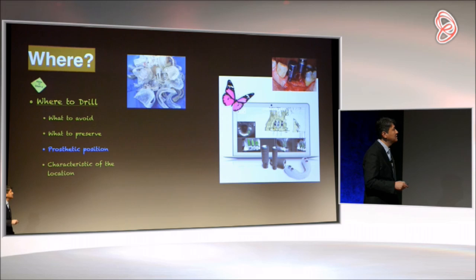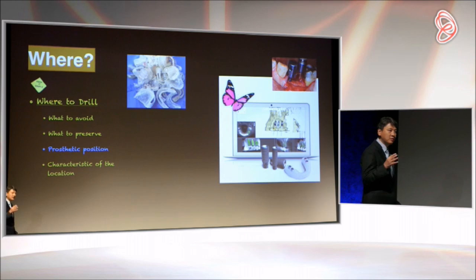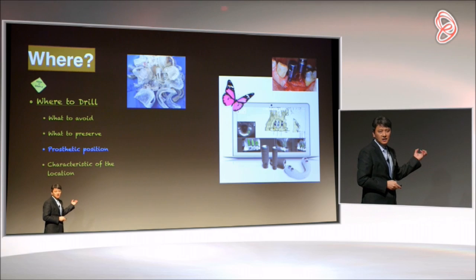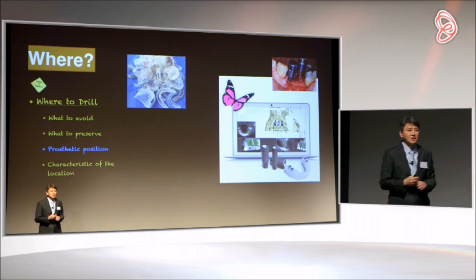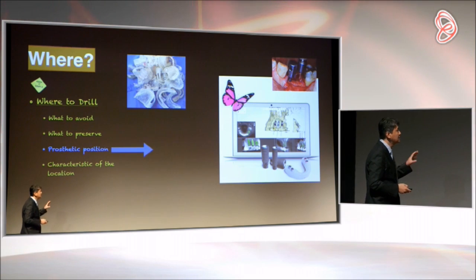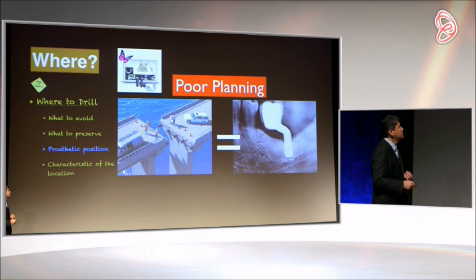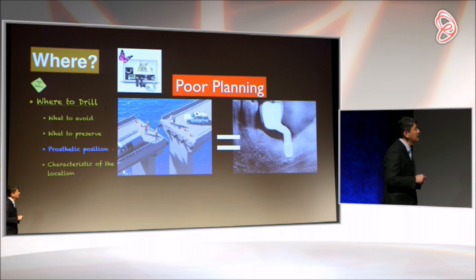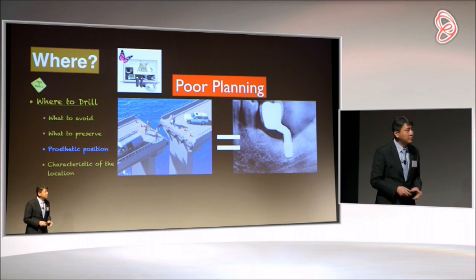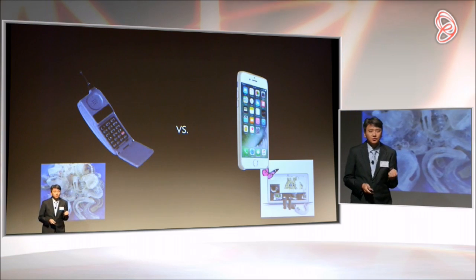So please utilize the iPhone 7 of implant, which is digital planning and guided surgery. Don't use the old technique. As Dr. Brower mentioned, this doesn't give us the angulation. It only merely gives us location. And it's not as accurate as guided surgery. So with proper planning, we can avoid blaming each other for poor outcome. With proper planning, we're able to deliver the best dentistry to our patient.